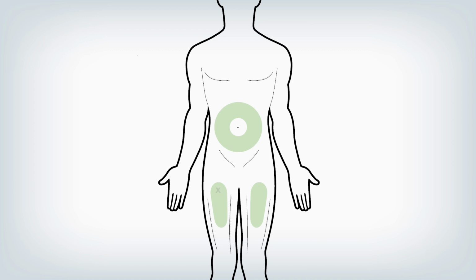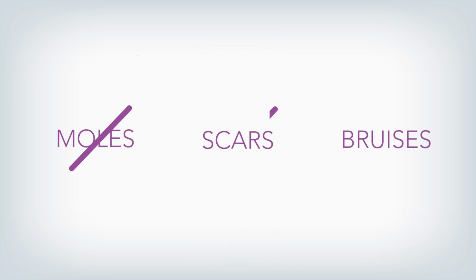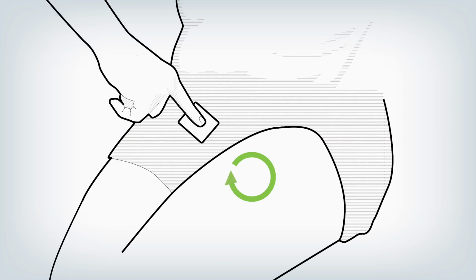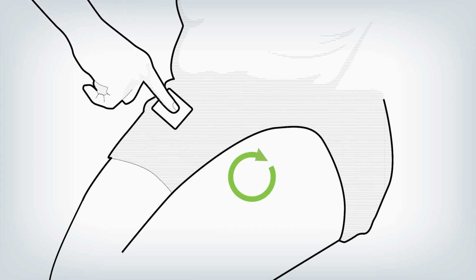To give your skin time to recover and prevent infection, always use a different site for each new injection, at least 3 cm or 1 inch from the last area you injected. Do not inject through clothing covering the skin or into areas that could be irritated by a belt or waistband. And do not inject into moles, scars, bruises or areas where the skin is tender, red, hard or not intact. When it comes to preparing your injection site, disinfect the site with an alcohol pad using a circular motion to clean a small area.